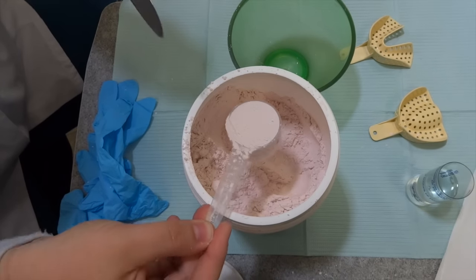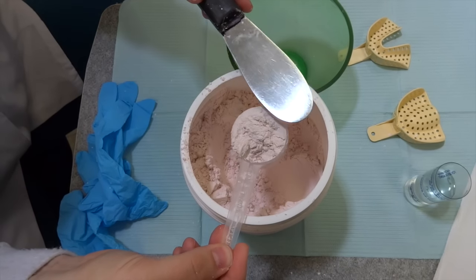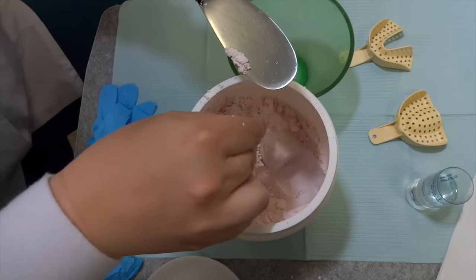When you scoop your powder, don't tap it on the side. Just do a nice scoop and then use your spatula to smooth it out so it's totally full.